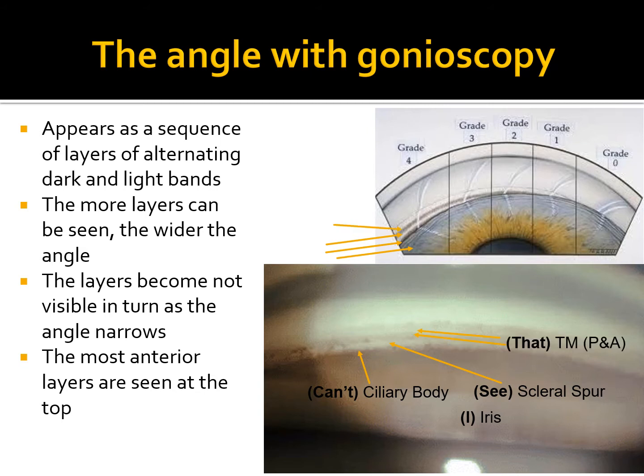And then you come to the trabecular meshwork, and that always had me slightly confused. I always muddle this bit up. We should always be working from the posterior forward. So posterior first, that's the darker colored bit, and that is the actual draining part of the trabecular meshwork, the functional part. And then we go into the lighter color, which is the anterior trabecular meshwork. And then finally, Schwalbe's line, which is the transitional zone from basically the sclera to the cornea. And as I've already said, you've got to look at a lot of normal eyes before you can realistically and professionally interpret a less normal eye. But that's theory, and if you get stuck in and practice, it all falls into place.